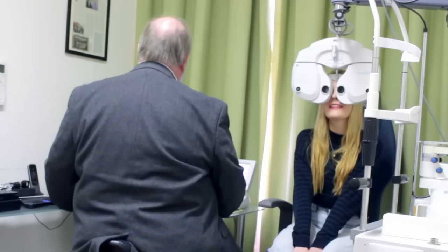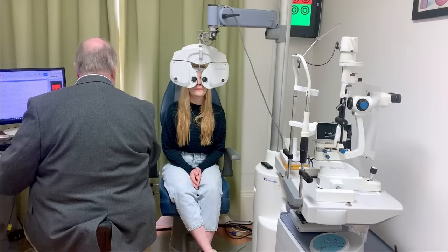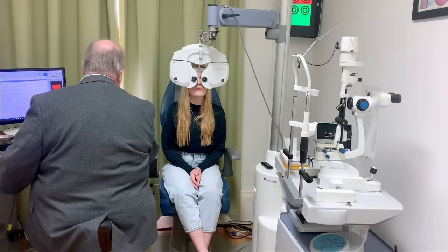Let's go back to red and green. I'm going to swap eyes, okay? There we go. And can you see the circles again for me? Yep. And which one this time stands out better? Red. Okay. Let's try that one. And this one? Green. A little bit? Yeah, a little bit. Okay.